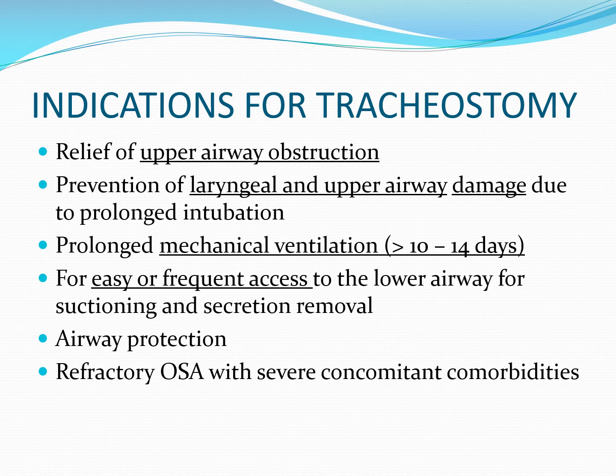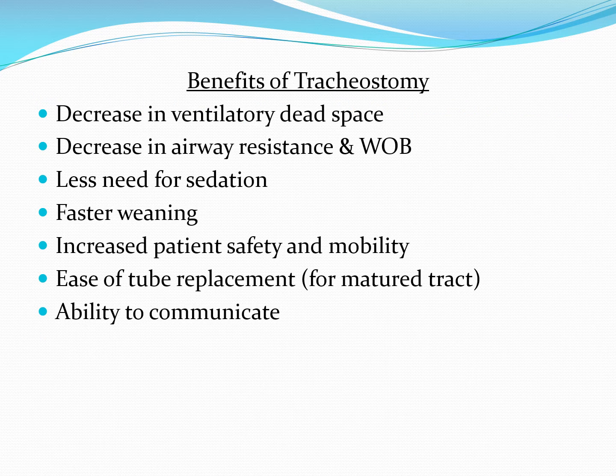Diabetes or worsening of diabetes, cardiovascular problems, hypertension, and others can be worsened by obstructive sleep apnea. So if the patient has those and they don't tolerate other treatments, this may be a way to address those things. So a tracheostomy tube can be a very effective way, although extreme, of treating obstructive sleep apnea. Some of the benefits of tracheostomy: decrease in ventilatory dead space.